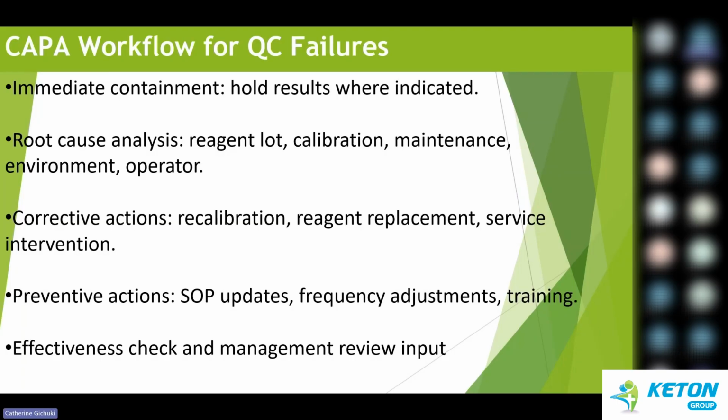So immediately we are supposed to contain. We are supposed to hold results where indicated. If QCs fail, then we are advised to stop releasing patient results, because that is an implication that if I am getting a low, my patients are also getting a low. So until the issue has been understood and fixed, you're advised to hold.